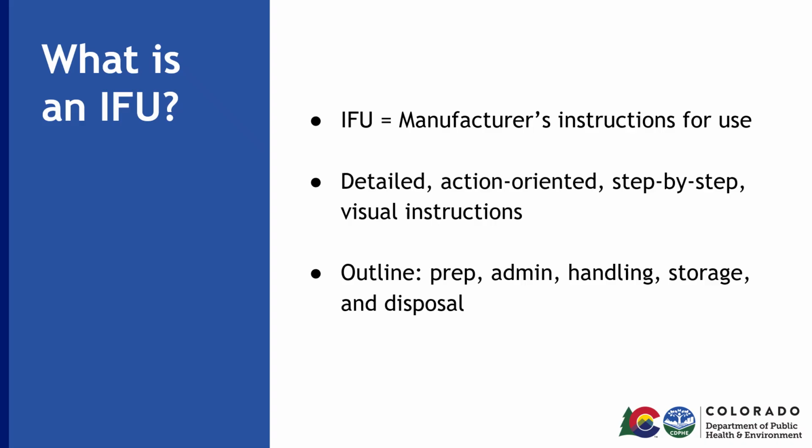Something else that you may hear IFUs being called are manufacturer's instructions for use. The main goal in the perspective of following IFUs within a healthcare setting is to provide understanding of how products and equipment are to be properly used and maintained to be most beneficial to that setting. Next, let's discuss FDA requirements.